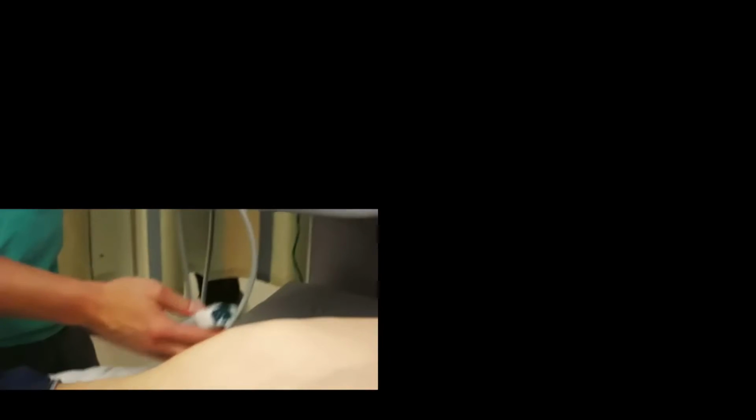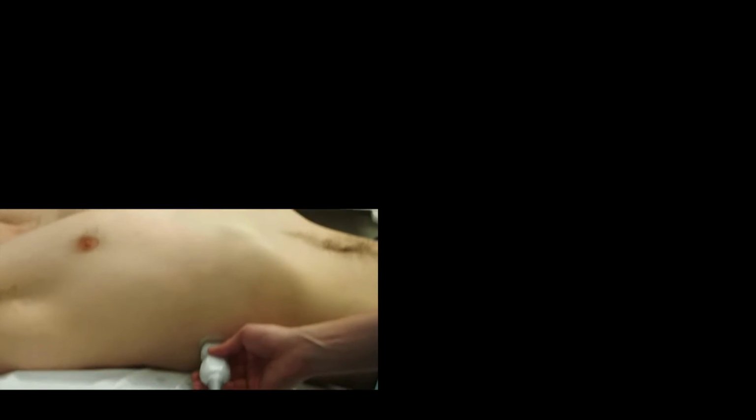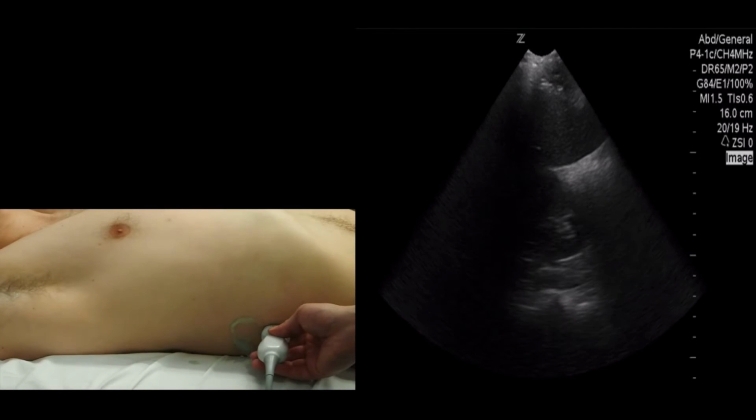A typical position for the patient is supine, with the hand raised above their head to open up the rib interspaces. You should stand at the patient's right with the ultrasound machine on your side. Apply some gel and use the low-frequency probes, either the curvilinear or phased array probes. Apply the transducer to the flank of the patient, typically on the right side first. Point the indicator of the probe towards the patient's head.